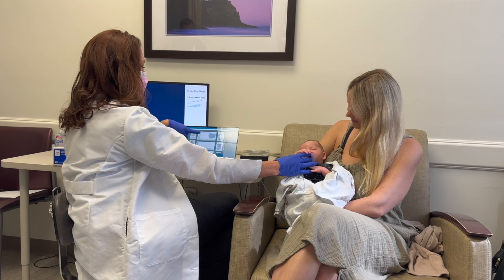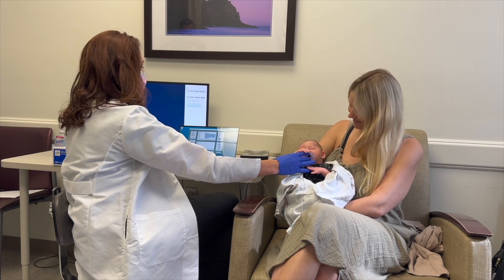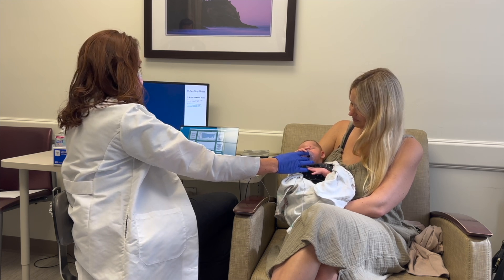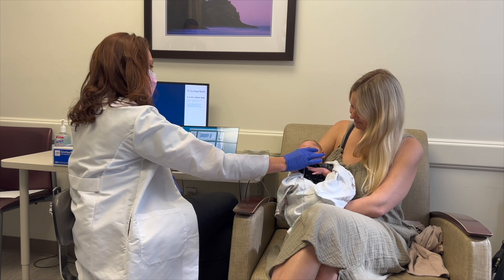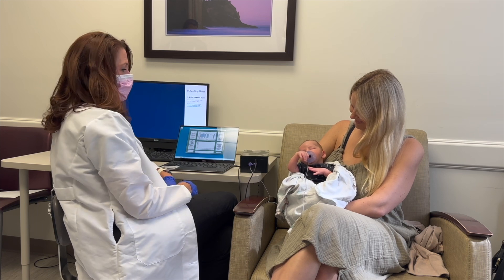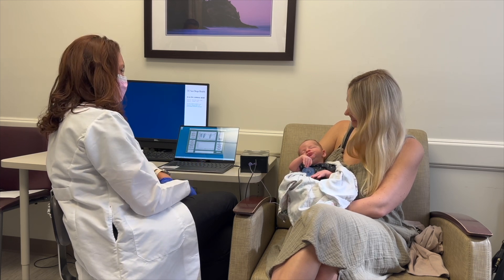So you can see while Henry is sucking, it shows us how strong he is, how often he's sucking, how many sucks we're going to analyze. You want to make sure that you don't start the experiment until the pacifier is able to equalize to just the ambient air. You want to get a good segment of his sucking that's representative of what he does. He's quite good at this — he doesn't even need us to hold it.